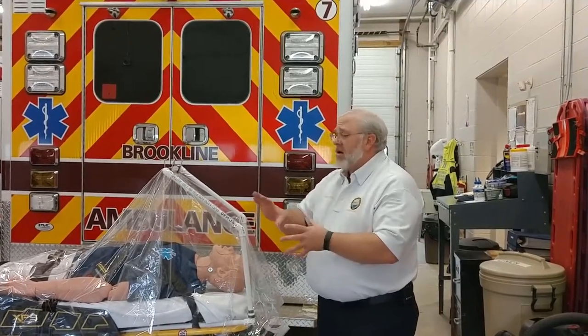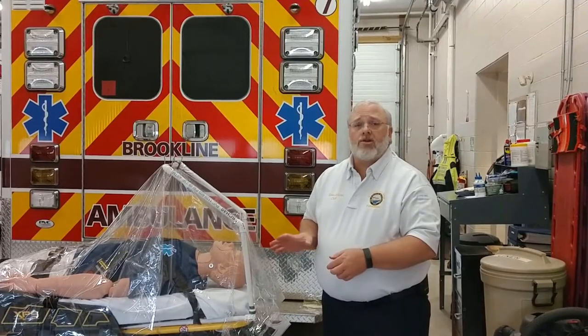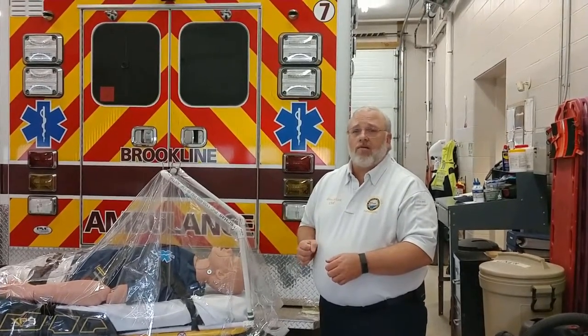The entire system is modular. It's made out of PVC pipe. It packs down pretty small and can be rapidly and fairly easily deployed over your patient should they need an aerosol generating procedure.